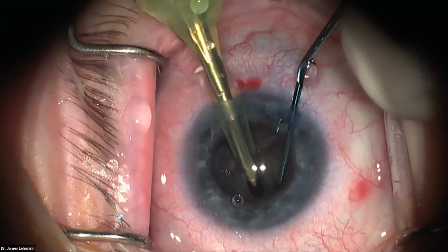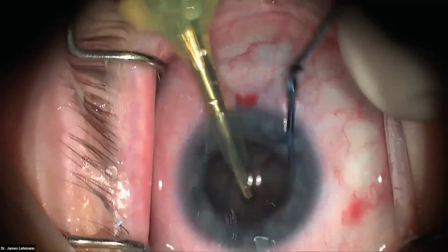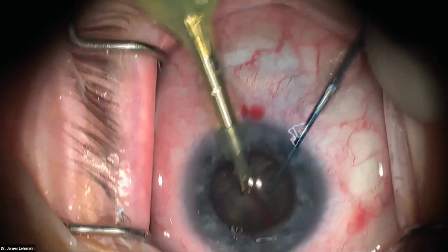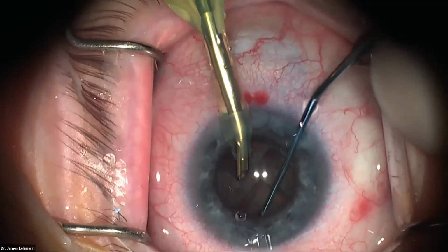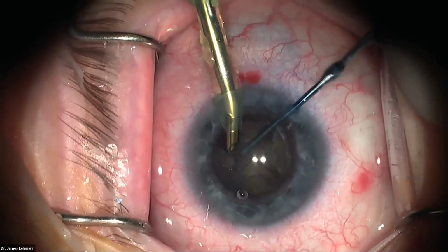Now we're going to crack it, go down deep into the groove there. And now when you know the air escapes, you're probably deep enough, but I want a little bit more. Okay, so now we go into quadrant mode, which is obviously to remove the quadrants here. And it's always easy to remove the smallest quadrant first, so that would be this one.